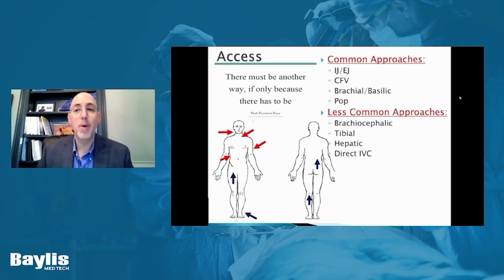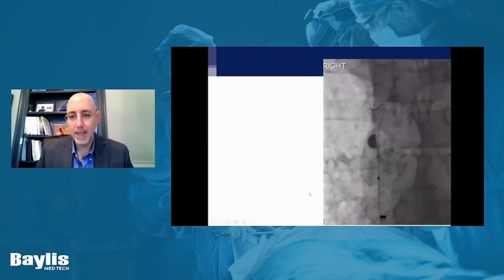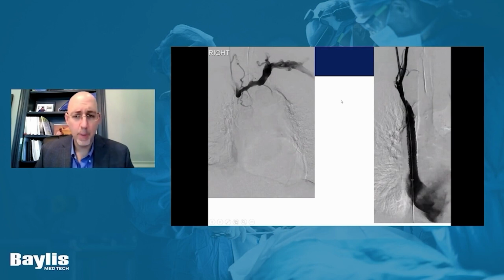Quitting at this point should not really be an option. And so that's exactly what I did, came from below, and this was actually quite easy to cross from below, and I was able to do that even when you can't cross from above. And then you stent with whatever you need to do, or just put a catheter in, or whatever it is you're there to do.